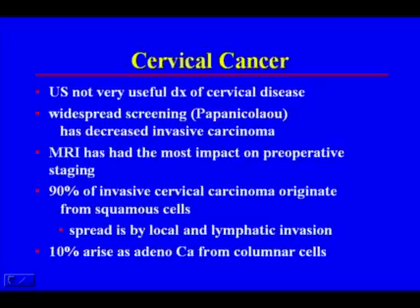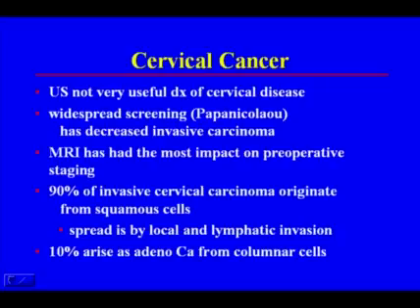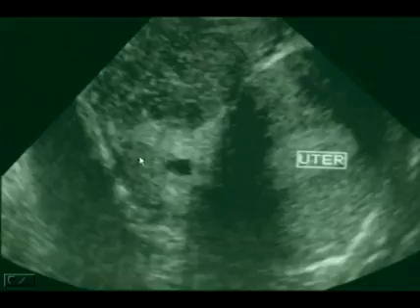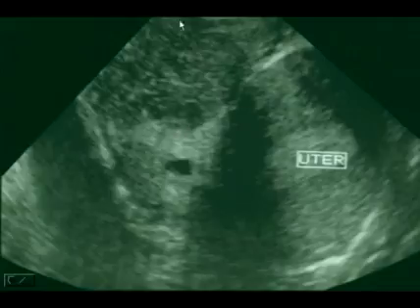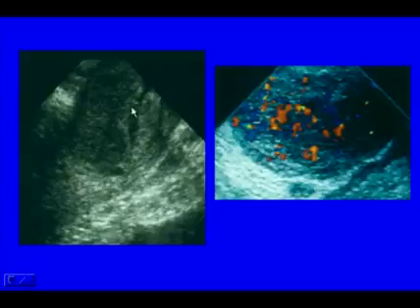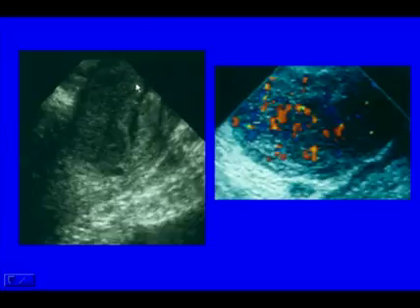Cervical cancer has decreased in recent decades because of widespread Pap smear screening. MRI has had the most impact on preoperative staging. The most common type is squamous cell carcinoma, and cervical cancer spreads locally and through lymphatic invasion. A transvaginal study of a retroverted uterus shows an irregular, heterogeneous mass in the cervical area with increased vascularity and apparent invasion into the mucosa — a large cervical cancer.